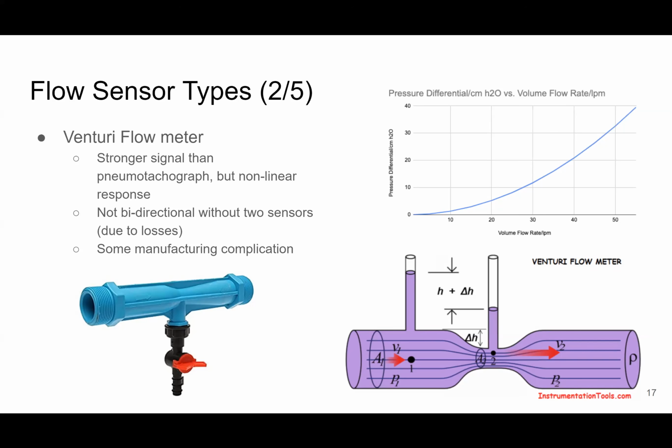As well, this isn't an issue as much in the current prototype, but it's not bidirectional, which was more of an issue before. So it's mainly that nonlinearity of scaling. Basically the first time we implemented this, the flow rates on exhale tend to be lower than the flow rates on inhale, and so we were systematically underestimating the exhale flow. That again is something that's probably addressable with a little bit more design effort, maybe differently sized.